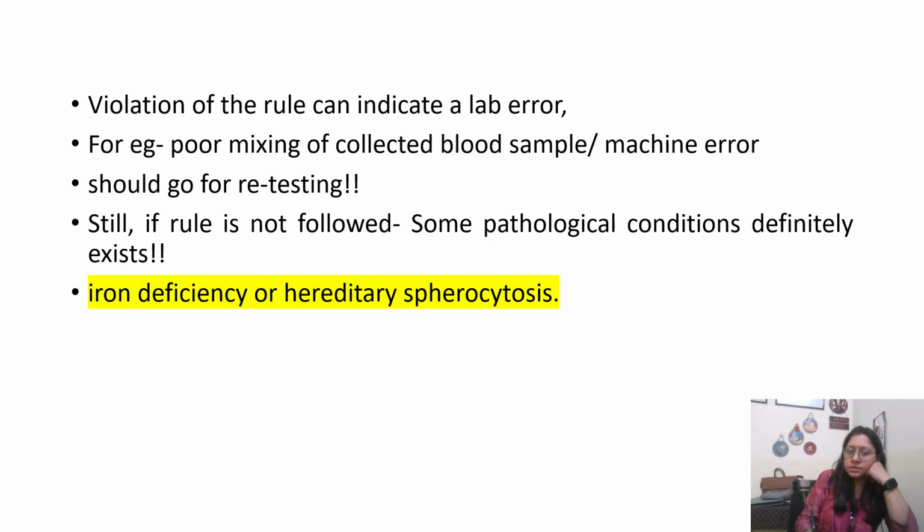So where does it occur? So first thing हमेशा हमें जाना चाहिए जो major 3 तरह के errors होते हैं when we report hematology. Basically you have your pre-analytical errors, then you have analytical errors. Pre-analytical is your collection, right? Collection है, naming of the sample, poorly mixing before you feed the sample to the machine. So all those are your pre-analytical errors. Analytical error में आता है processing. और processing के बाद जो result interpret करते हैं, that is your post-analytical error.